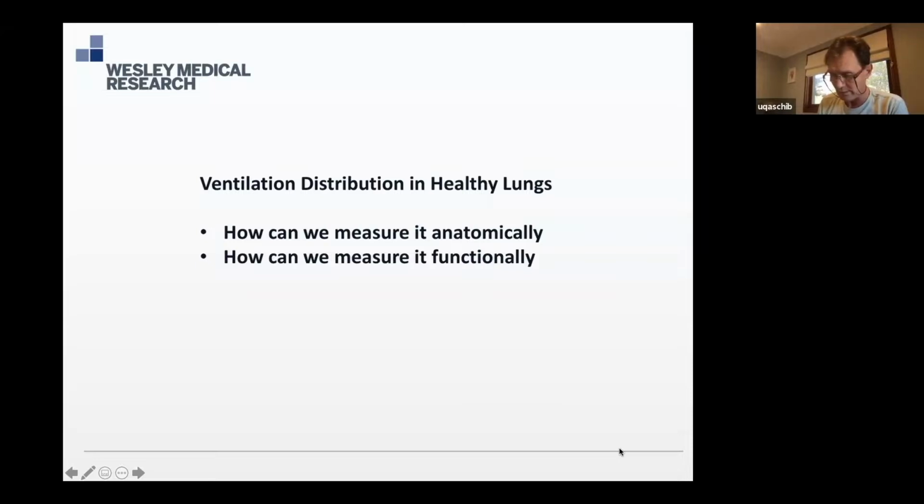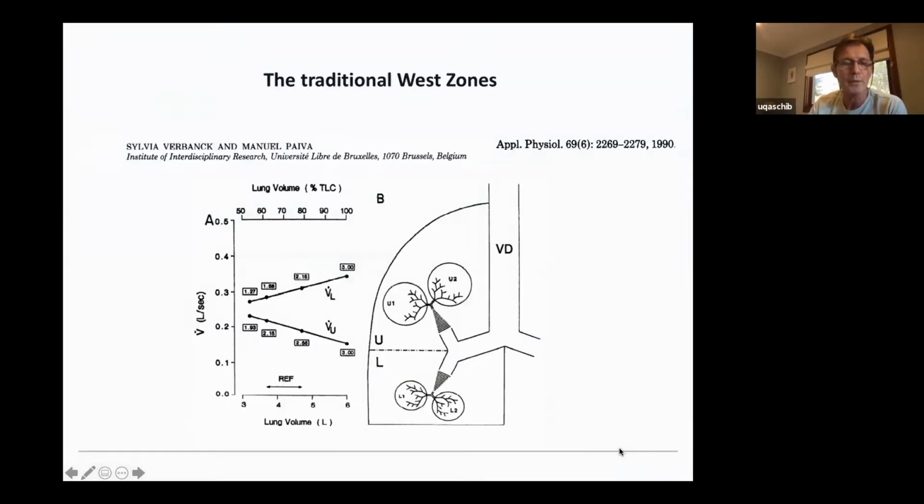We lost the infrared sensor that measured sulfur hexafluoride during the ventilation. We lost that technology about 20 years ago. Siemens had one, and they just didn't produce it anymore, didn't think it was important, and didn't pursue it any further. And so I'm still hoping that a ventilation company will jump on and recognize this is actually a very useful technology. And I'll talk in detail about how that can operate.